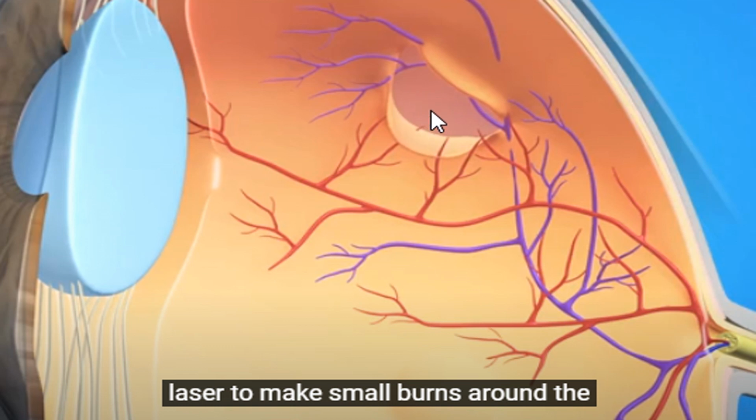At the end, we have a tear. How can we deal with it? If we want to seal the retinal break, we have three schools or three ways, as we discussed in the last session: laser photocoagulation, which is great but needs easy accessibility; cryotherapy, when you have difficult accessibility and you can operate from outside the eyeball, but it's somewhat destructive to the sclera and the conjunctiva; and diathermy, which I call the old school, which is no longer very common.